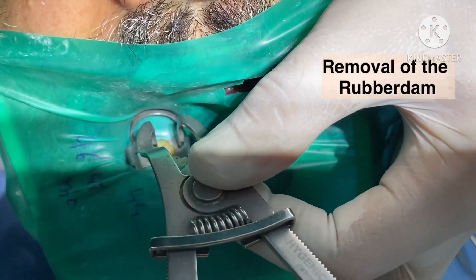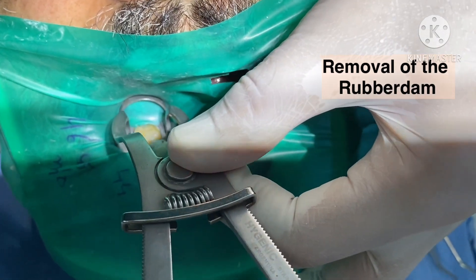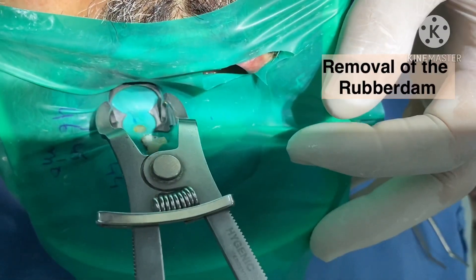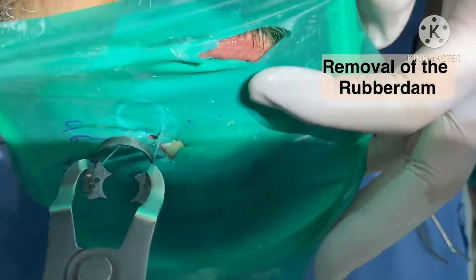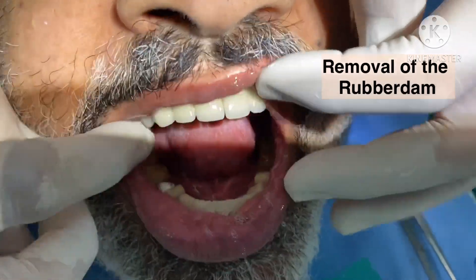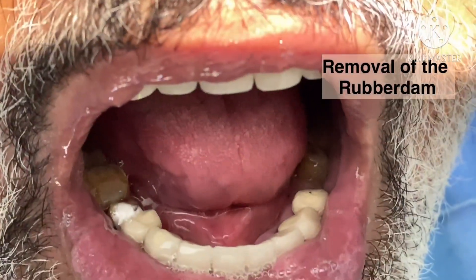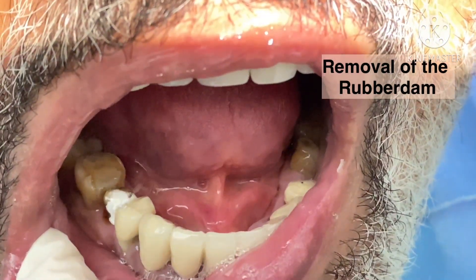We place the prongs — I am doing it from the back side, it is very difficult but anyway — then expand and take it out. Now you see the filling is intact. The filling has not come out from the interdental space because we have cut the rubber dam stretch.